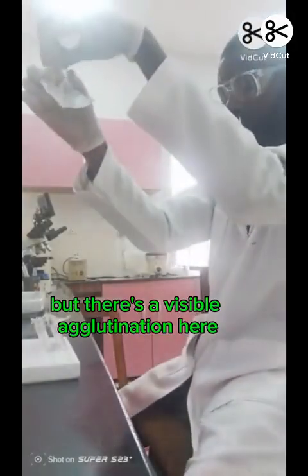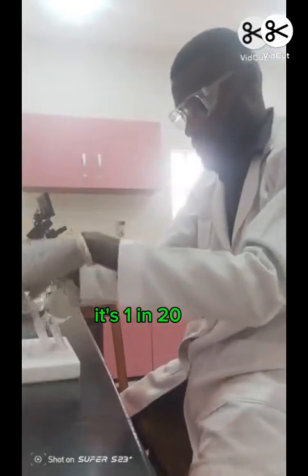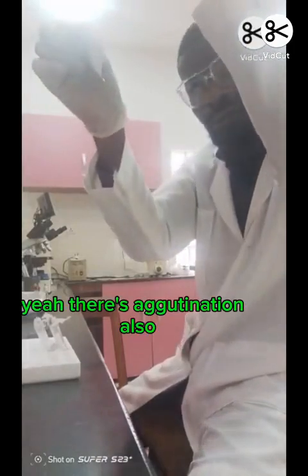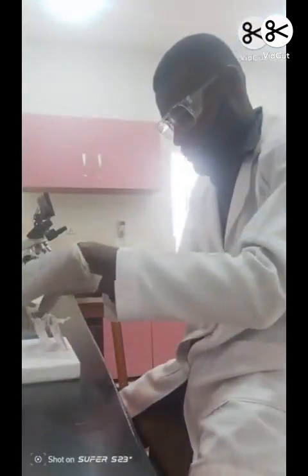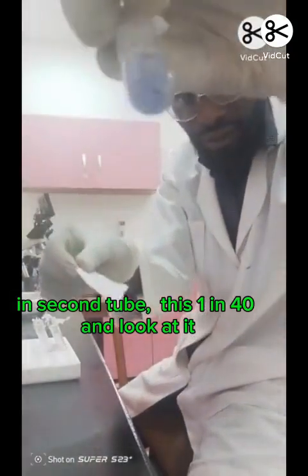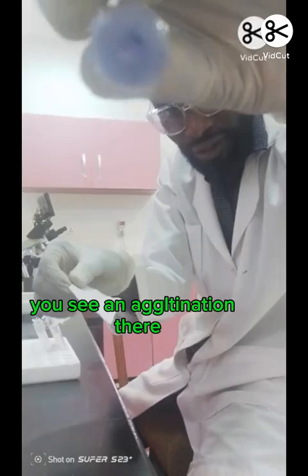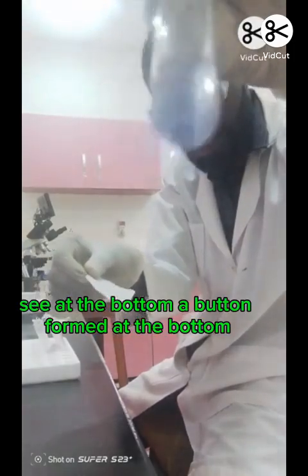There's a visible agglutination here. It's 1 in 20. Yeah, there's agglutination also. And the second tube is 1 in 40. And look at it. You see an agglutination there. See at the bottom, a button formed at the bottom.